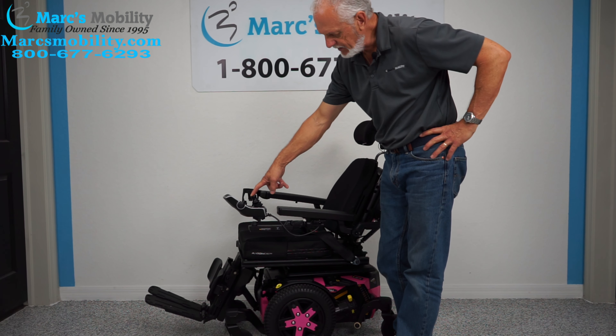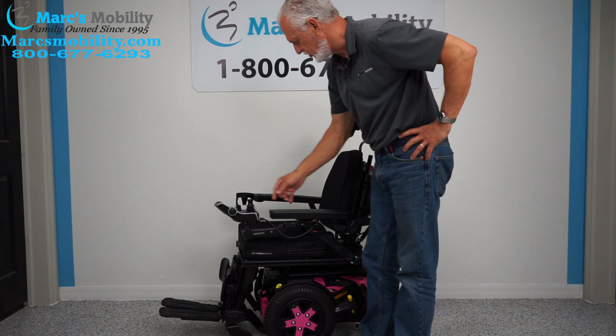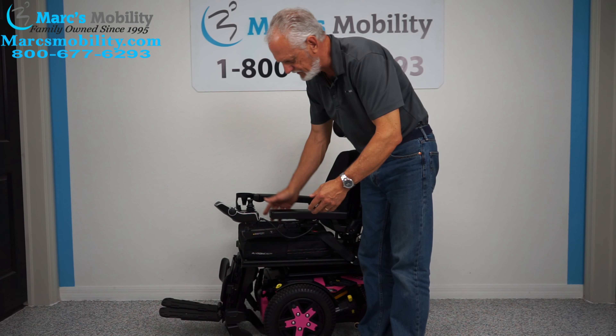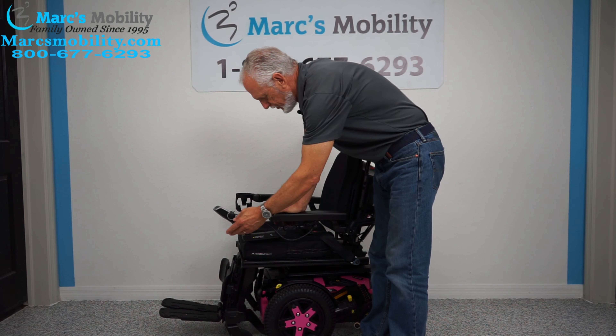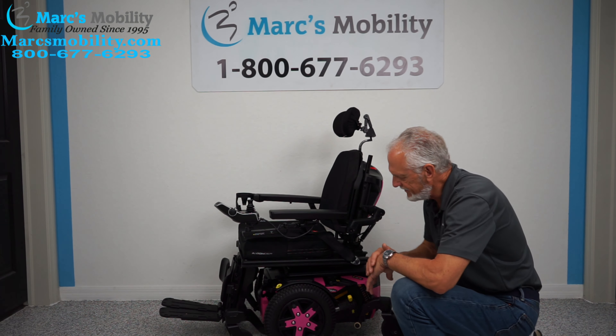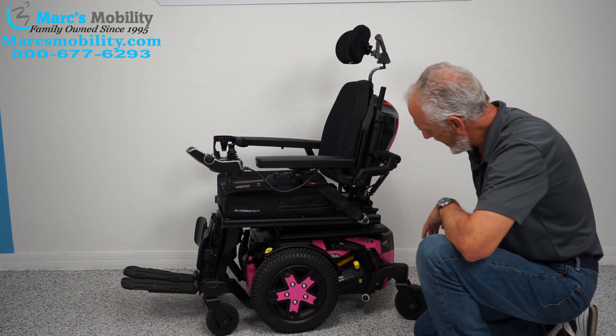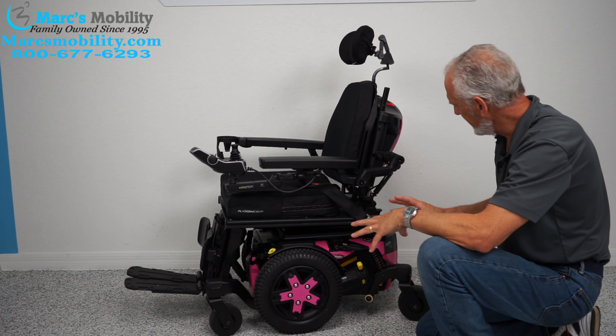These are marvelous chairs. If you ever get one of these, you'll wonder how you could ever live without them. If you look at the back of the chair — just the way it's built, it's built like a tank.